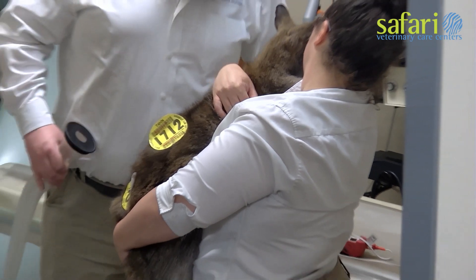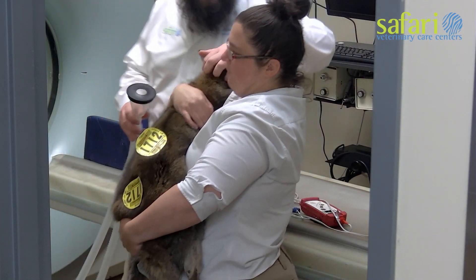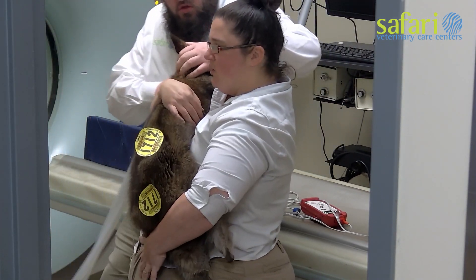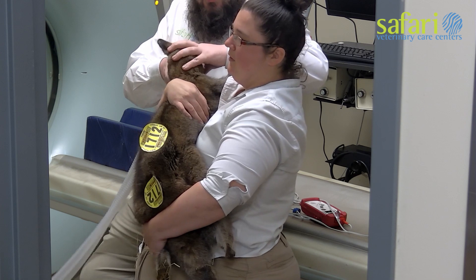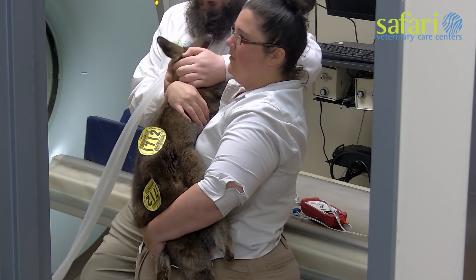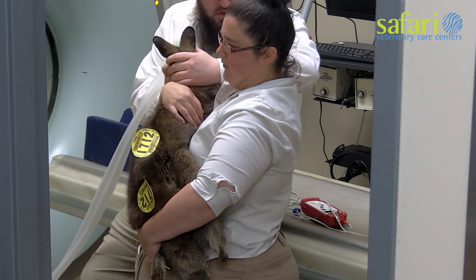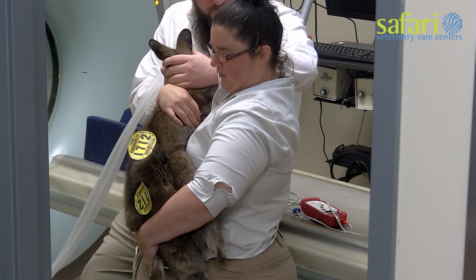We plan to do a CT scan on the wallaby to see what's going on with its mouth. The jaw seems to be swollen, so we are passing gas into the wallaby using a face mask, while one technician holds it and another administers the gas.